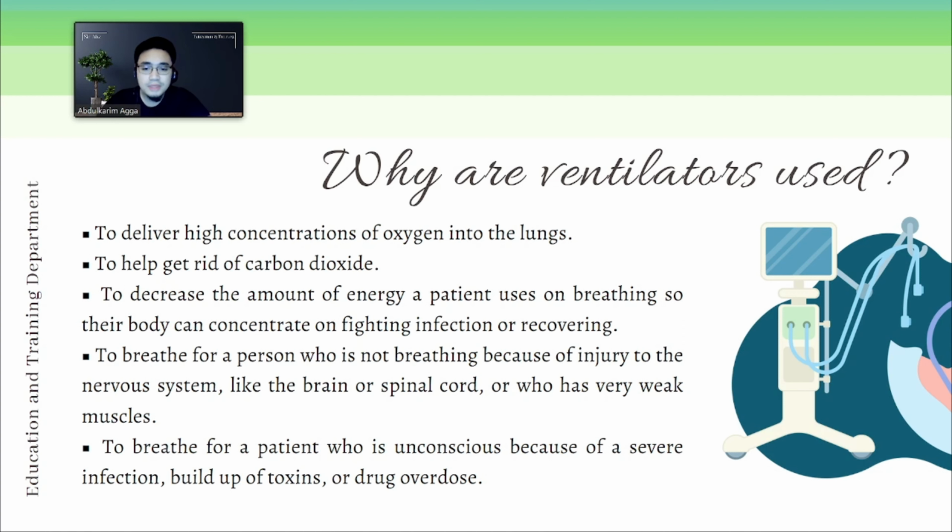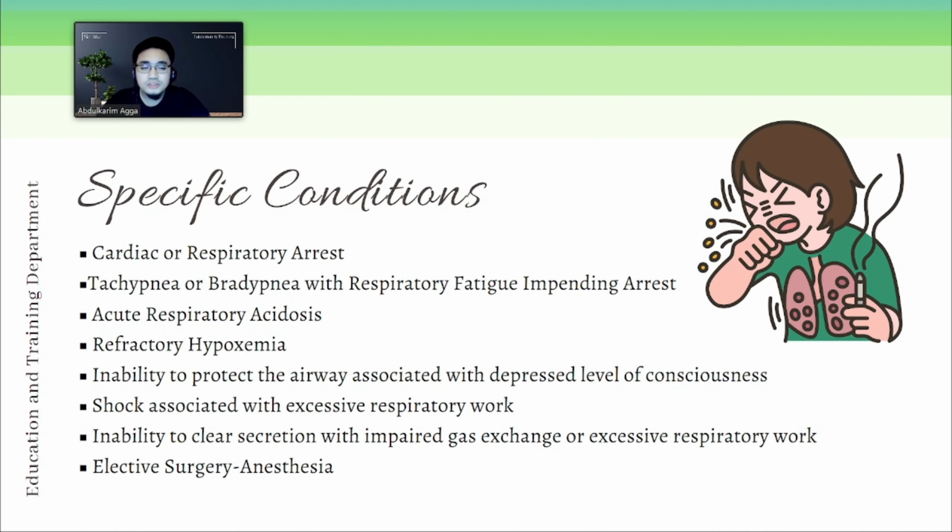To breathe for a patient who is unconscious because of a severe infection, buildup of toxins, or drug overdose, you can use your mechanical ventilators. Okay, so specific conditions.